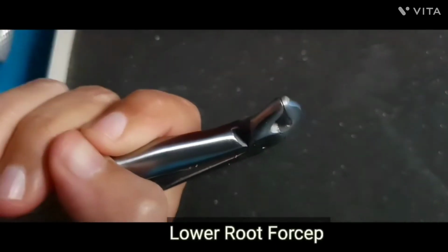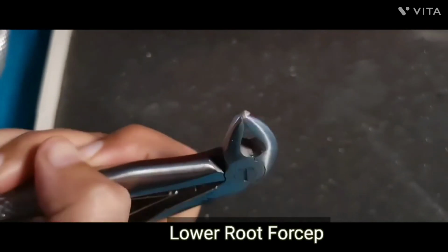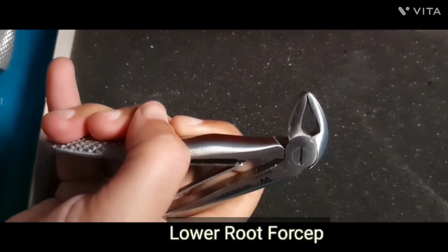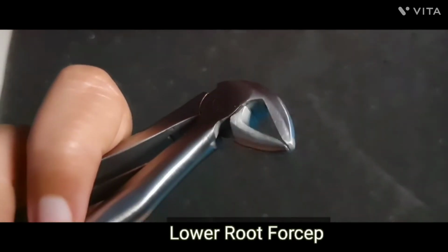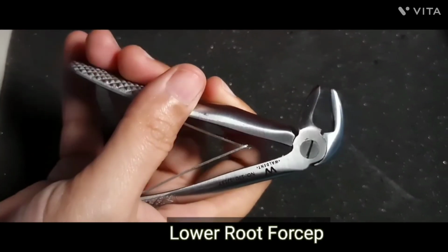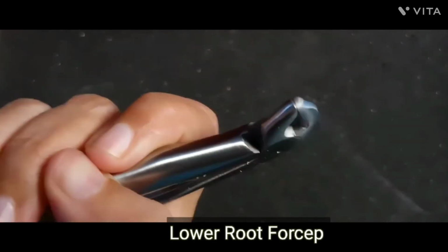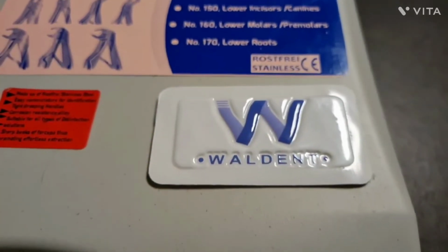The seventh and last forceps from the kit: you can see the beaks close completely for this forceps, and therefore we can identify that it is a lower root forceps. It is used for removal of lower root stumps if there is any root stump left inside, and as the beak closes you can identify that it is a lower root forceps.